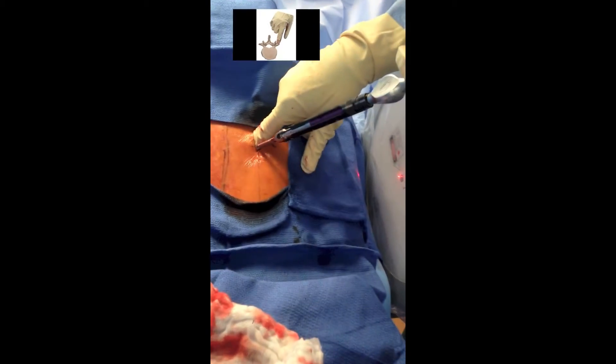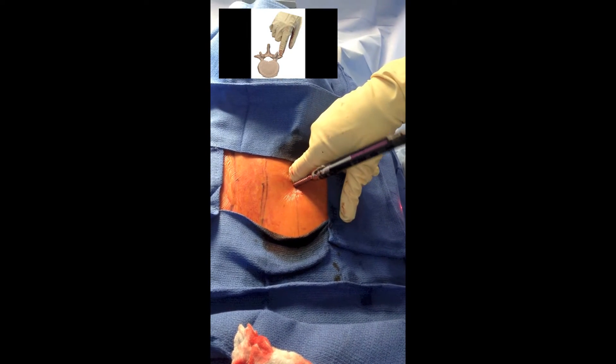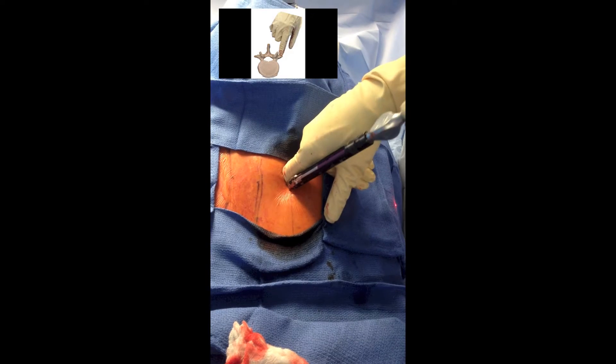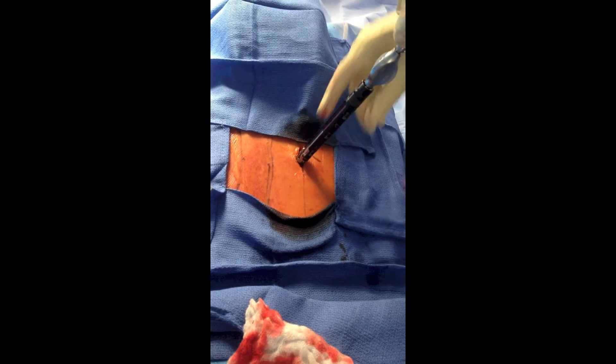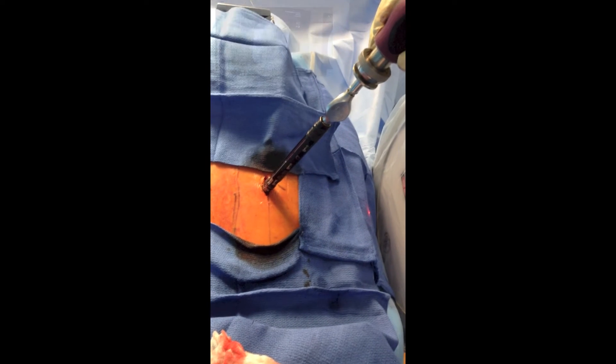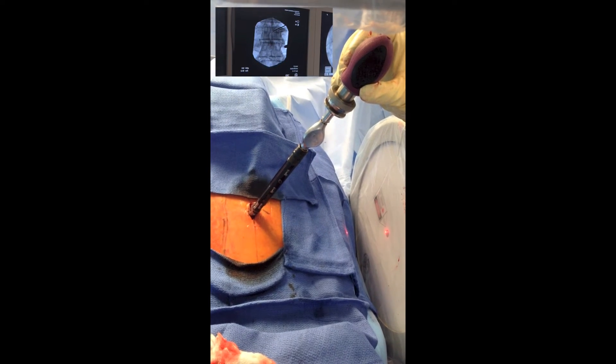After incising the fascia, we use our finger to dilate the paraspinal muscles and palpate the facet-TP junction. The screw is then guided down and placed at our starting point with a simple tactile response. The starting point is checked with both AP and lateral fluoroscopy.